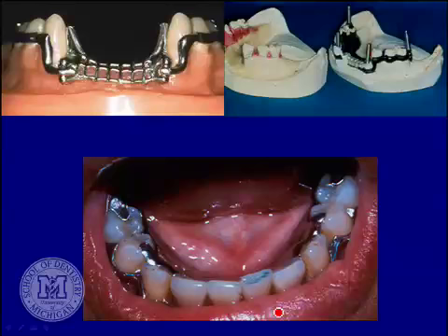But like I say, I want to show you the Swinglock partials as much as anything. So if you've heard of them, you sort of know what some of the indications might be, mostly maxillofacial. And nowadays that we have dental implants available to us and the possibility of recontouring teeth much more easily, either by high-speed recontouring or using bonded composites, they're far less necessary.